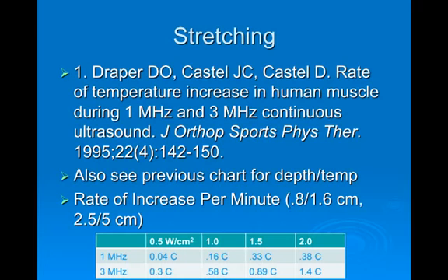A couple of things to note is one is just how quick the temperature comes up looking at your 3 megahertz. At 1 watt, which is close to where you're going to be using it, 0.8 to 1 watt per square centimeter, about a half a degree per minute. And out at 2, it's 1.4, and that's pretty rigorous. I mean, people are not going to tolerate that. So our typical range for 1 megahertz is there at 1.5. So you get about 0.33 degrees C per minute, and the 3 megahertz, the one to note is that they're at 1. Okay, so that's how long it takes to heat things up.